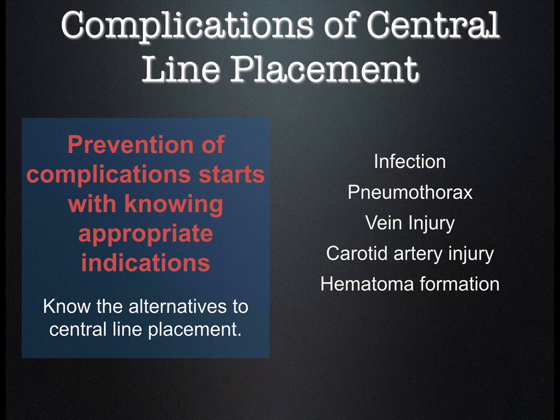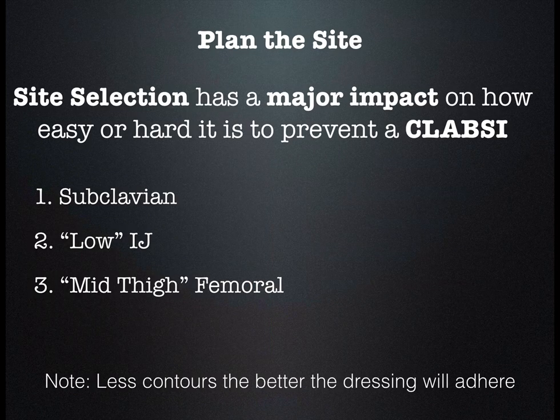for vascular access. The other thing you need to remember is the safest central line is the one you didn't place. So if you can get by with a PICC line or a midline or a long dwell peripheral IV, those are much better alternatives than a central line.